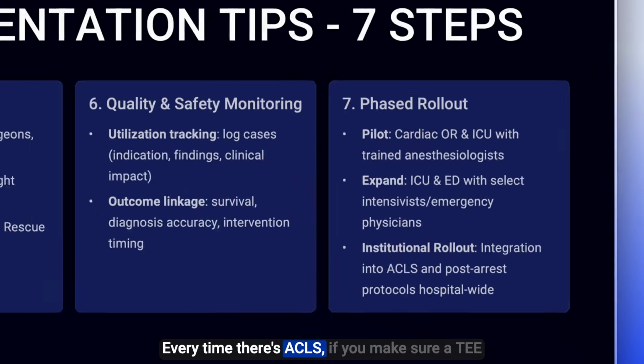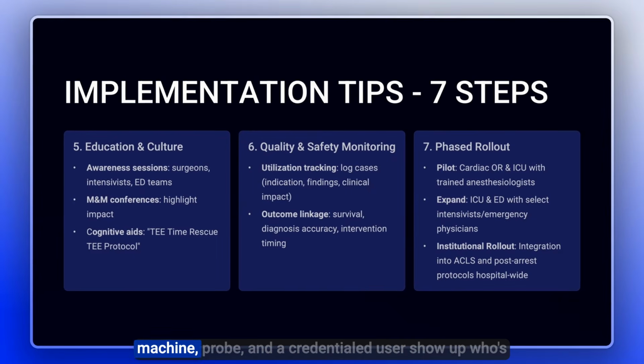Every time there's ACLS, if you make sure a TEE machine, probe, and a credentialed user show up who's available to use it to help guide post-arrest management, this can be of significant benefit to your patients.